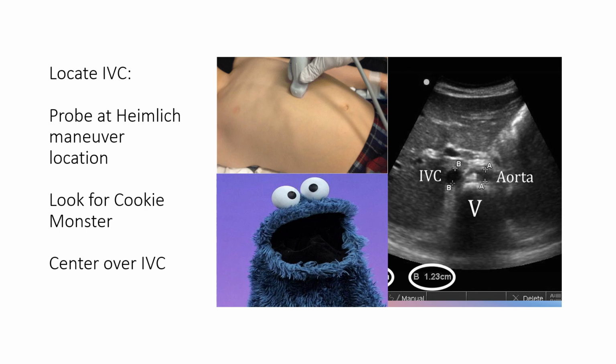Again, if the patient has high venous pressures, so they have an elevated central venous pressure secondary to pulmonary embolism or cardiogenic shock or heart failure, etc., fluid overload, that compressibility will be less noticeable than in a person who might be in a hypovolemic or vasodilatory type state. But those are your things.